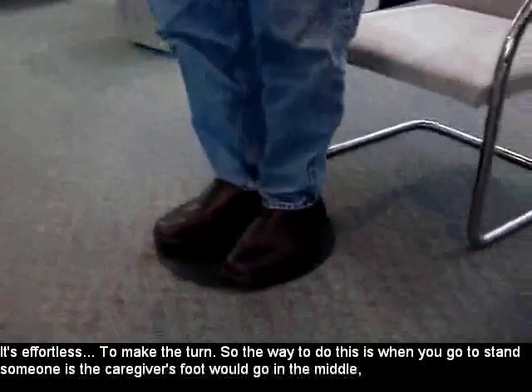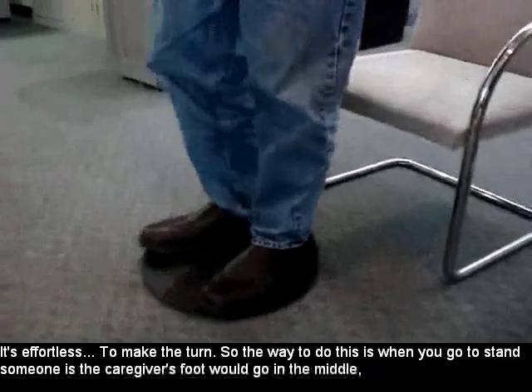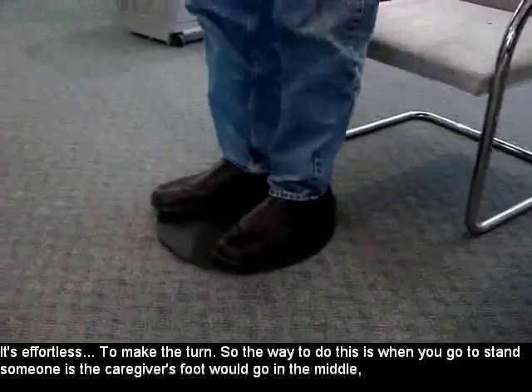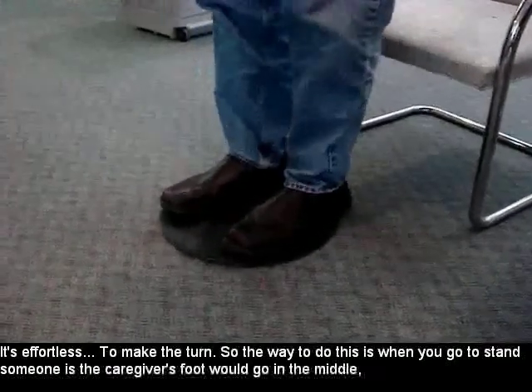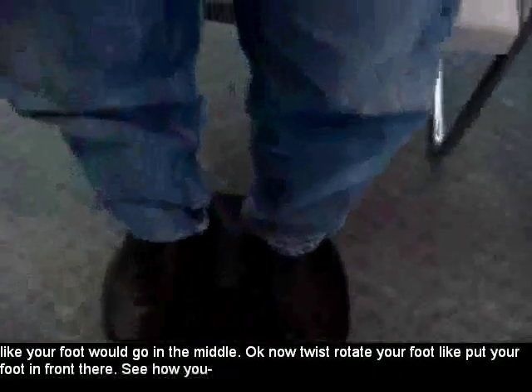It's effortless to make the turn. So the way to do this is, when you go to stand someone, the caregiver's foot goes in the middle. Like your foot would go in the middle.